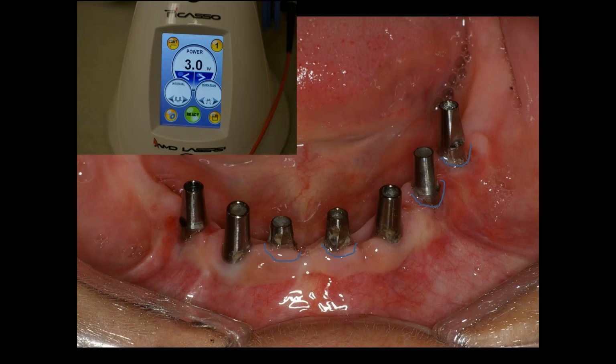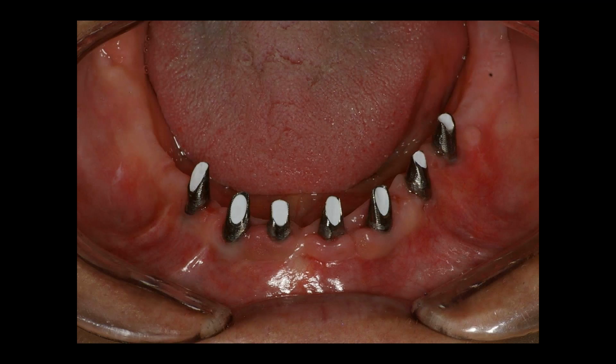This is 1 week post-op. You can see the difference in her smile already. We had a little overgrowth of our gingival tissue, so we use our Picasso laser to just laser that. So these were stock abutments used and placed once. We prepped these stock abutments once the tissue had healed after our laser treatment.